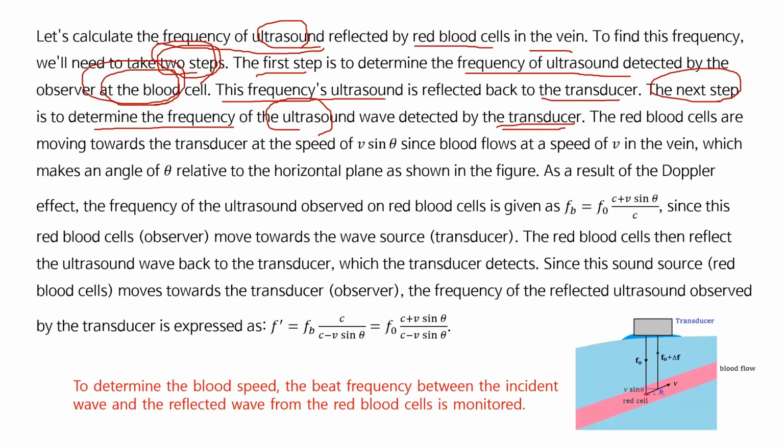So this ultrasound wave is reflected from the red blood cell.